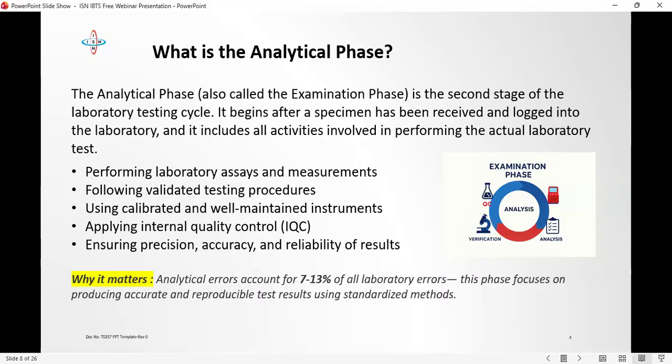That decision might seem small in the moment, but it introduces systemic error in every patient result that follows. Okay, so when you overlook that QC and say it's just a little bit above the range, let me just continue like that for the day, you've introduced systemic error into that system, and it will affect subsequent results that have been produced from that analyzer.